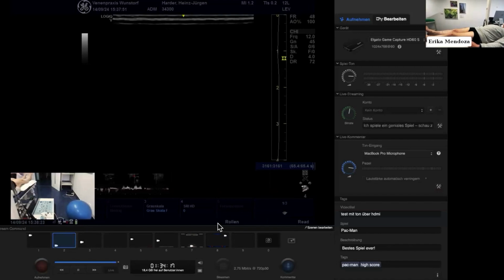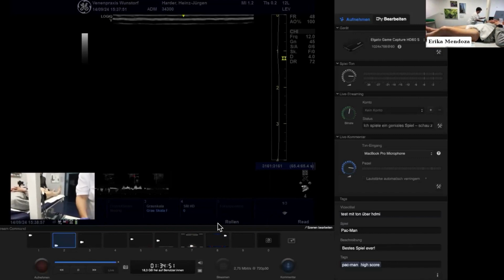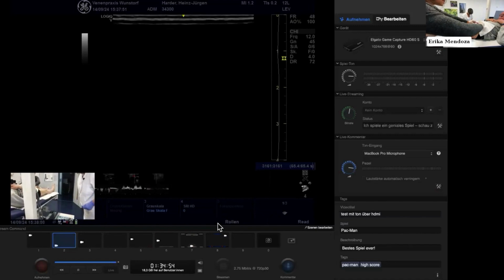Absolutely, absolutely. So you create a spasm around the vessel to collapse, and then you do your sclerotherapy at this stage. Absolutely, and I can show you in many instances where we do it. You start with a 10 or 20 millimeter diameter vessel, and when you're ready to give the foam sclerotherapy, it's down to about 2 and 3 millimeters. And if you do the calculations, you can obviously extend a hell of a lot further. Back to you, Professor. Okay, thank you very much.